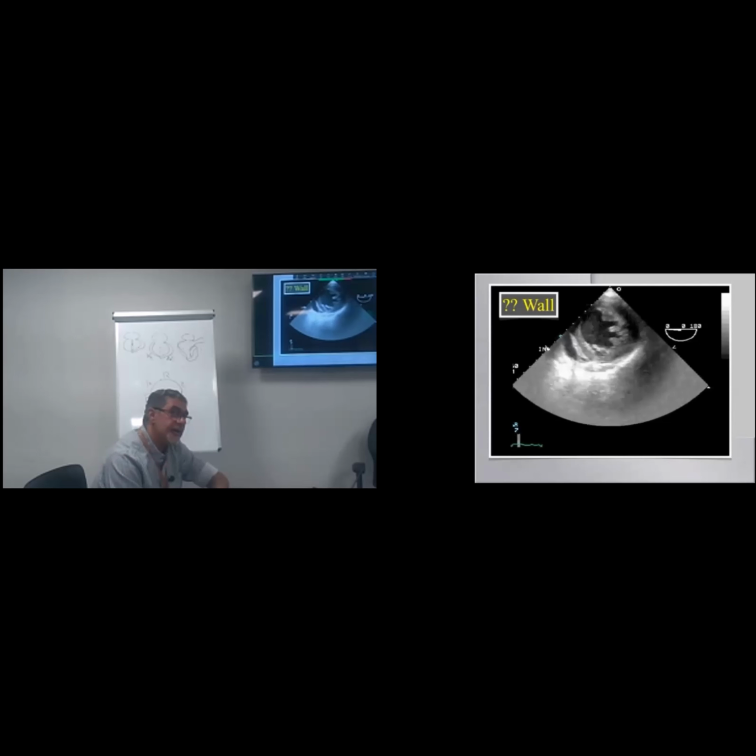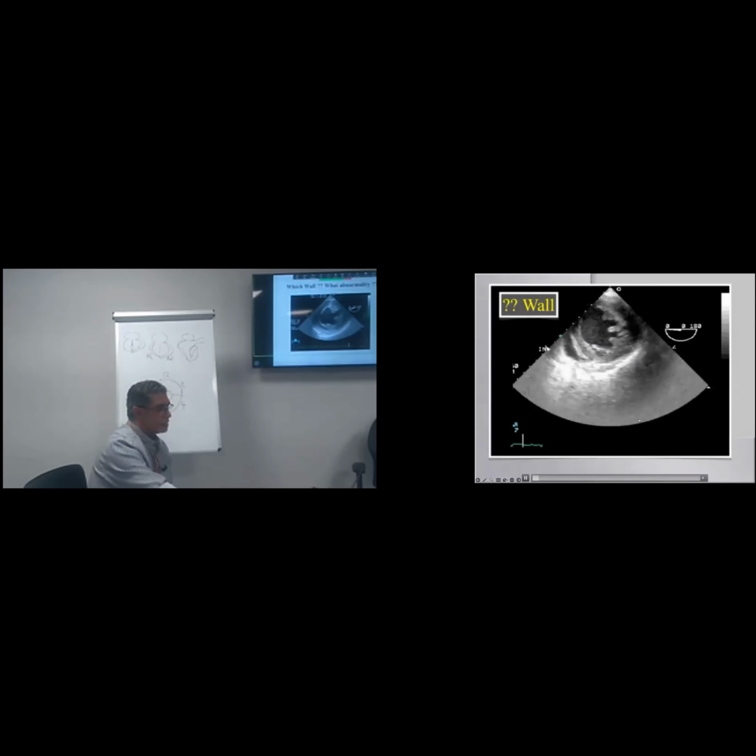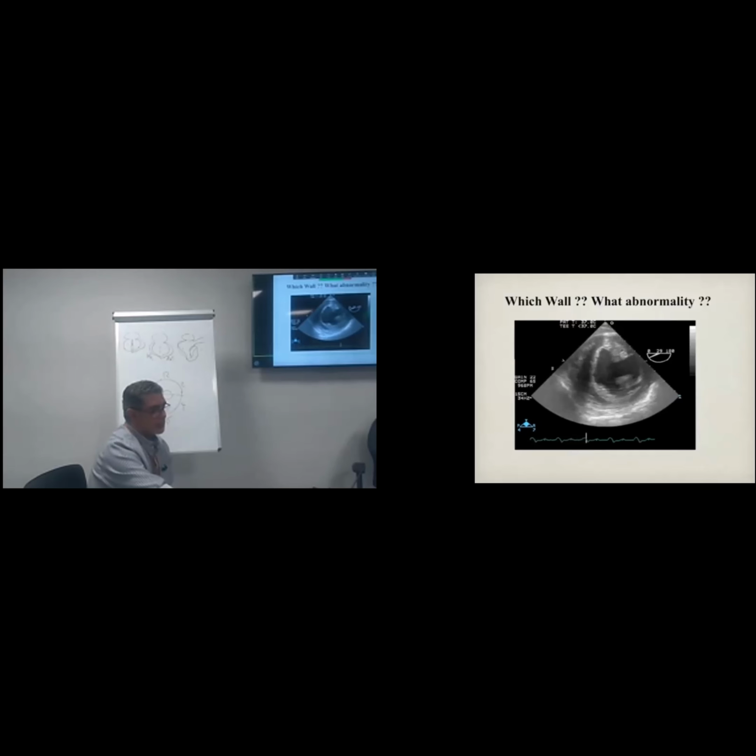Anteroseptal. It's LAD. Yes, anteroseptal. This is easy. No, comment on the RWMA. We are here to comment on the RWMA, not the etiology. Etiology is in your mind, in the field of surgery.